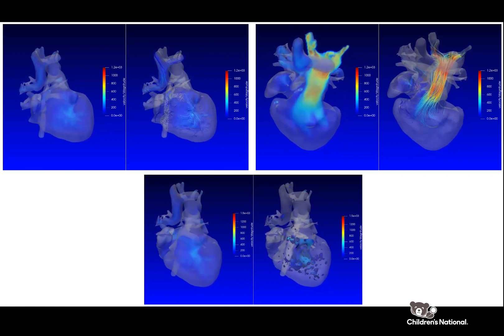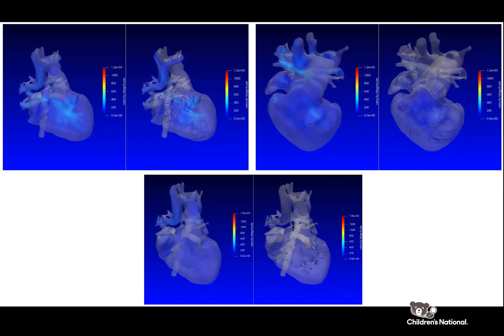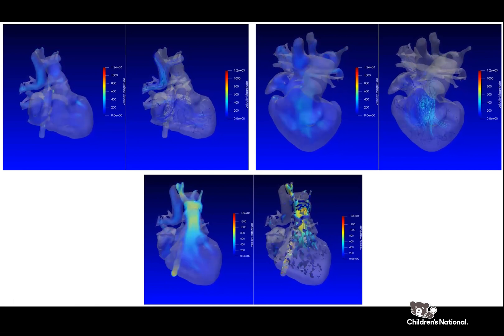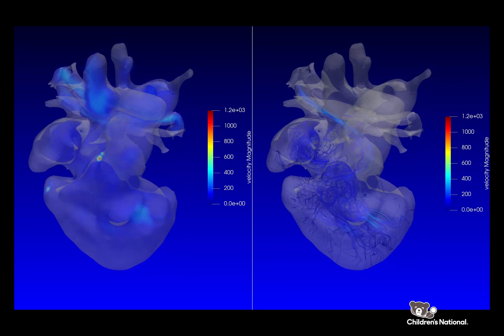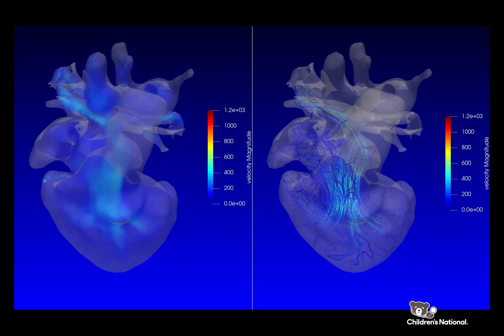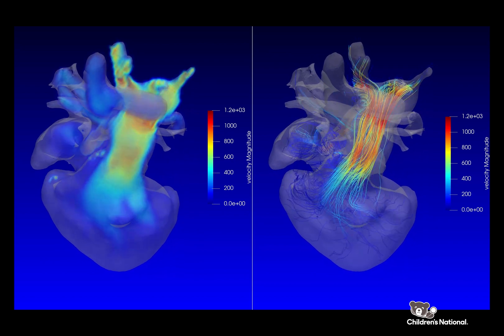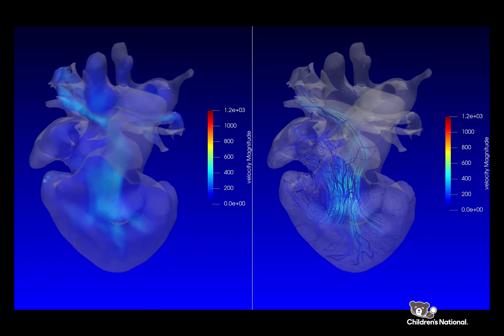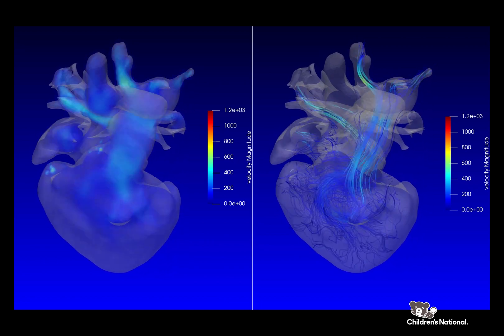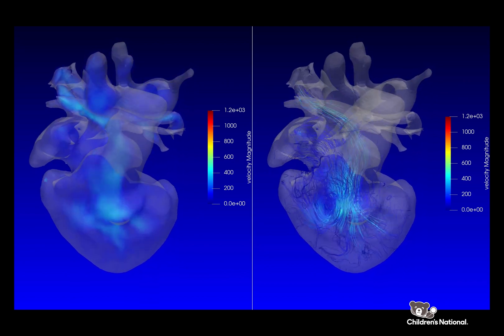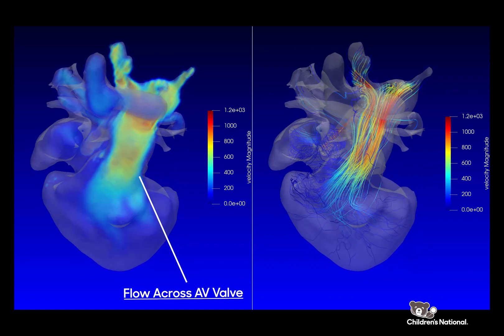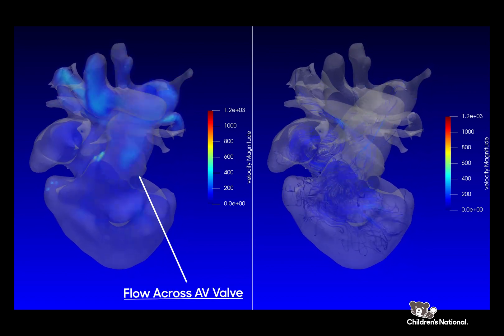We are investigating ways of measuring heart health beyond the size and squeeze of the heart. For example, we can look at the blood flowing through the heart and represent it in the form of streamlines as shown here. In this video, you can see that the view of the heart is now altered so that you can see both the ventricle — the pump — as well as the atrium, the chamber that is on top of the ventricle, and the blood flowing in between there, which is across what's called the atrial ventricular valve, the common valve that separates the two chambers.